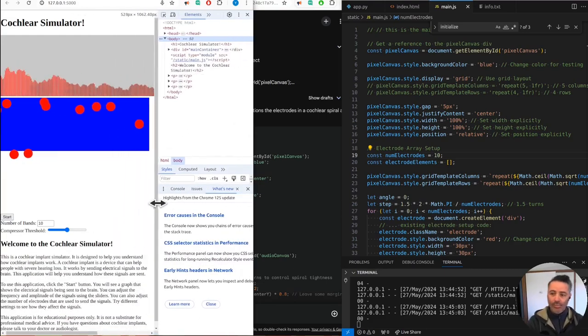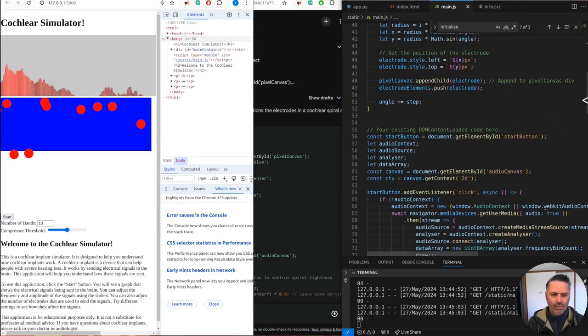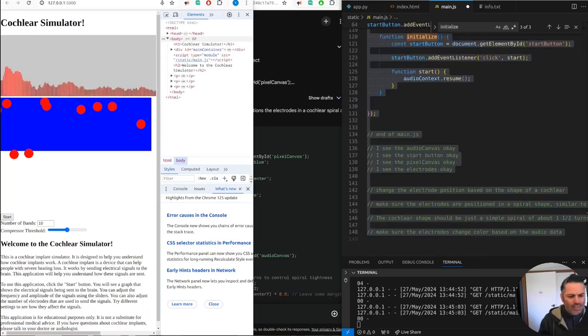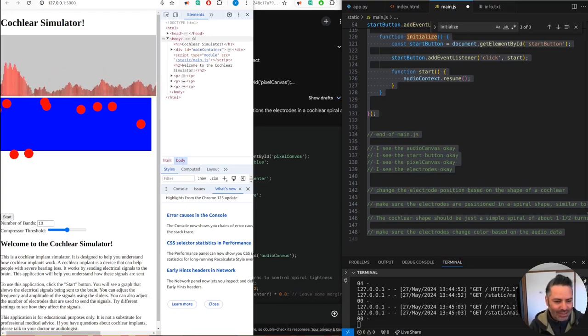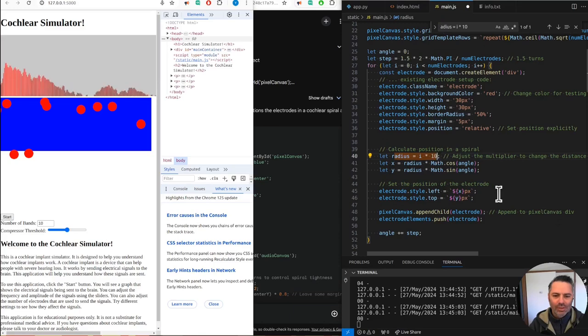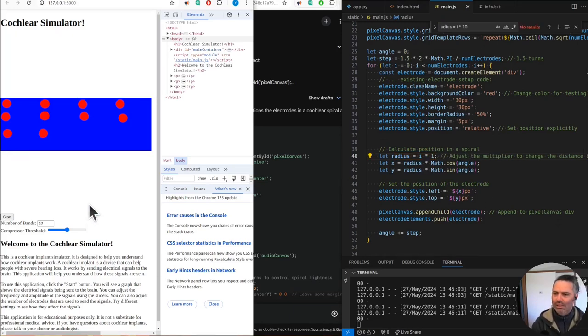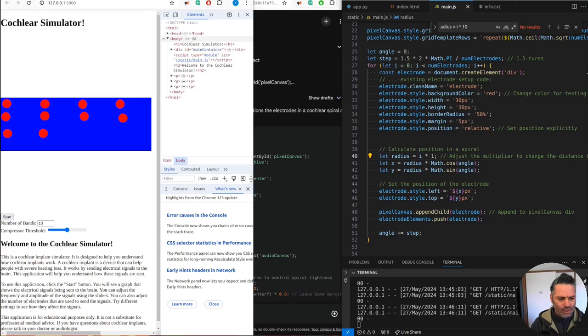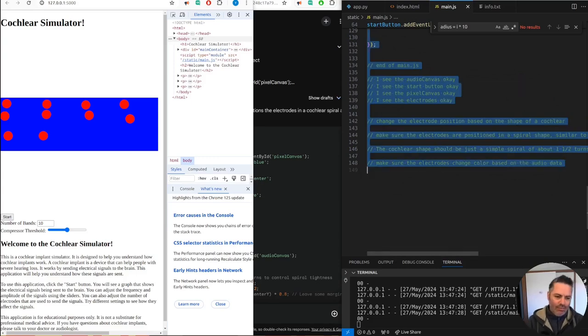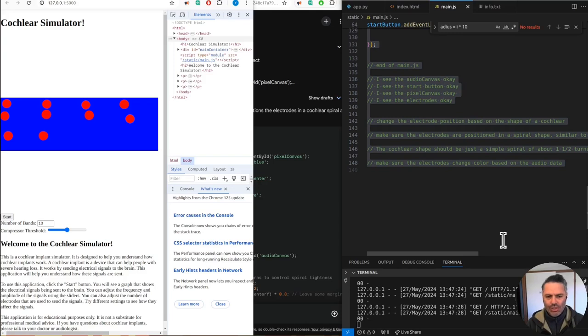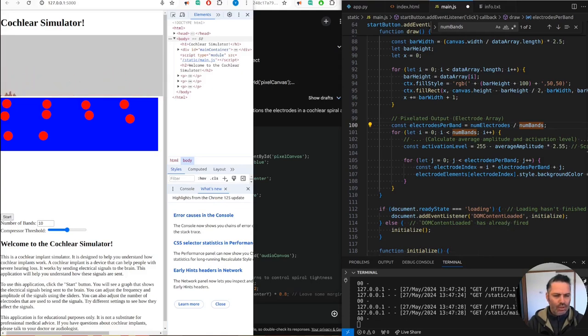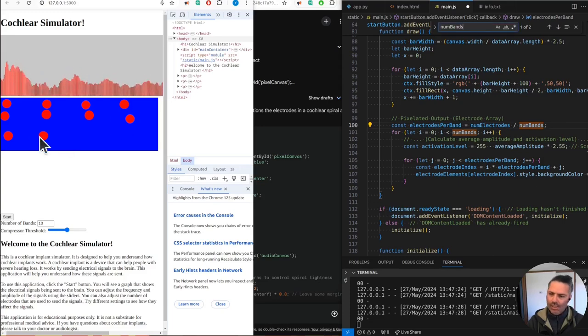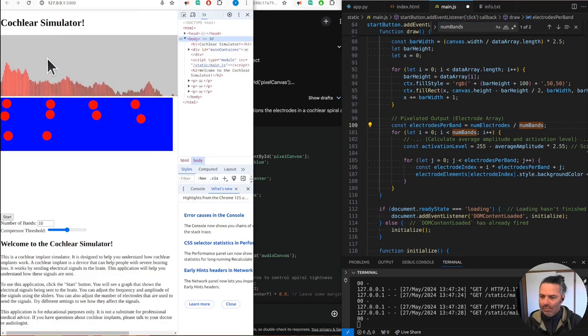The multiplier should be one. This creates the spiral that expands outwards with each electrode. The main functionality is that we want to change the color based on the audio data. We want to calculate the average amplitude for each frequency band. The idea is you have those electrodes in a cochlear-like shape, essentially a spiral, and then the sound is divided into whatever number of bands depending on how many electrodes we have.